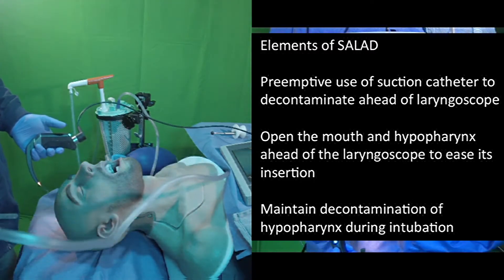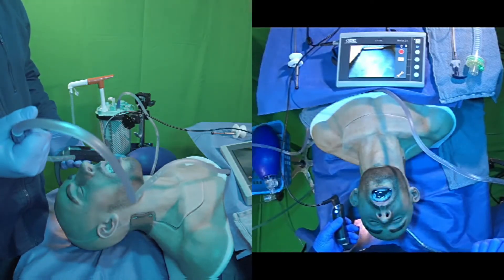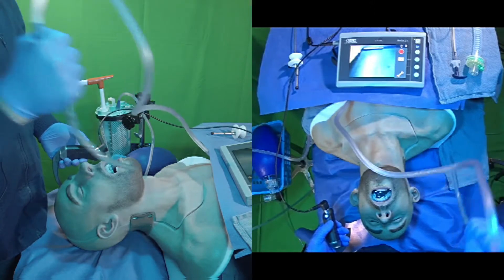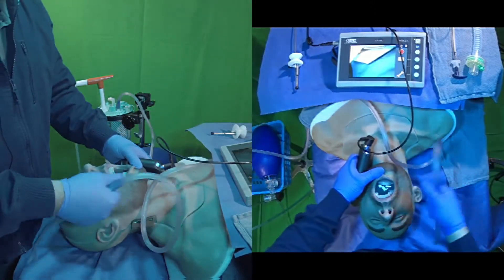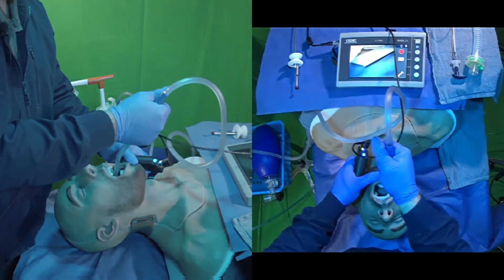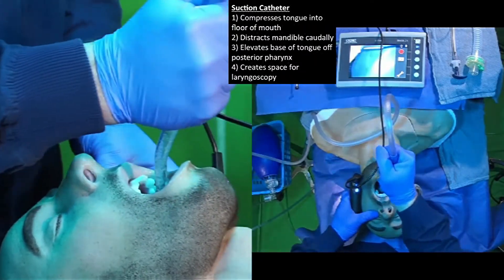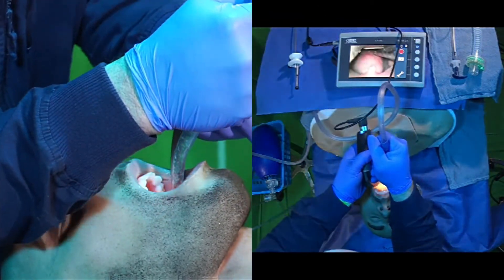We're always going to go into the airway with a suction catheter first, holding the DuCanto catheter kind of backwards from the traditional Yankauer catheters. Overhand grip gives us a lot of force and control. We're going to open up the mouth, lead in with the suction as far as we can see, working our catheter back and forth. At this point we can get control of that tongue, pin it up against that mandible, and then drive that mandible caudally and anteriorly to ease insertion of our laryngoscope.